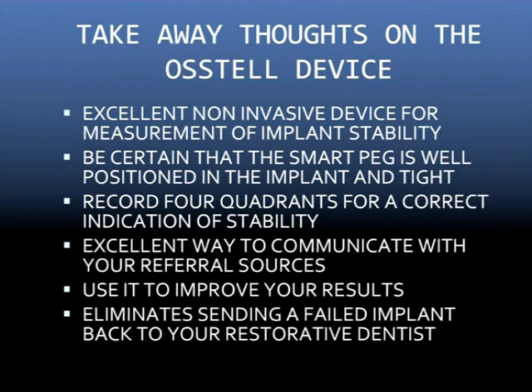It's an excellent way to communicate with your restorative colleagues. Or if you're a restorative colleague, it's an excellent way for you to discuss things with your surgeon. And I think it helps me improve my results. It makes me understand where I can do things more aggressively versus less aggressively. And finally, I think it eliminates sending a failed implant back to a clinician and going through the process of then having to redo the entire process, which, like Danny said, in my practice, we redo everything at no charge. So the less we can do of that, the better off we're going to be.